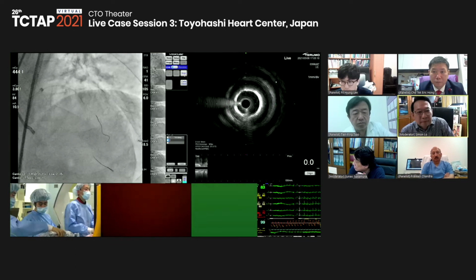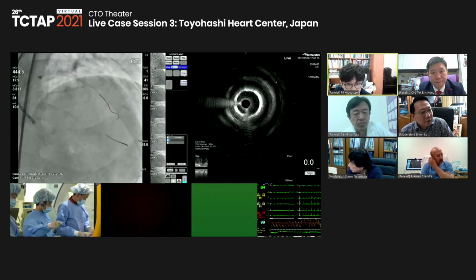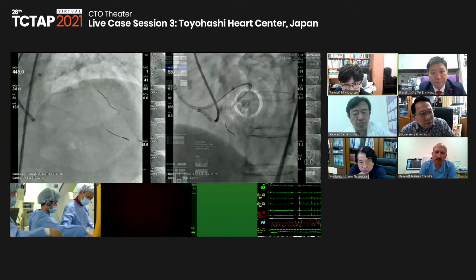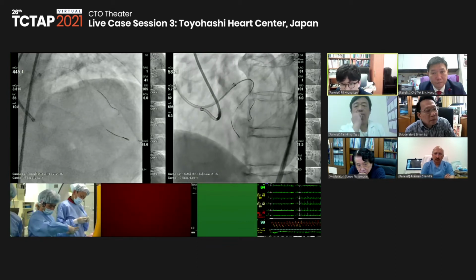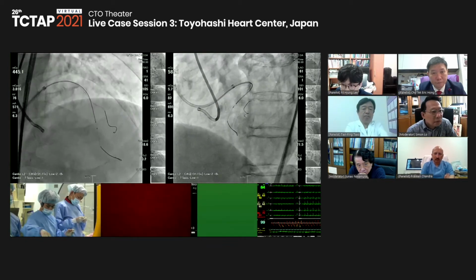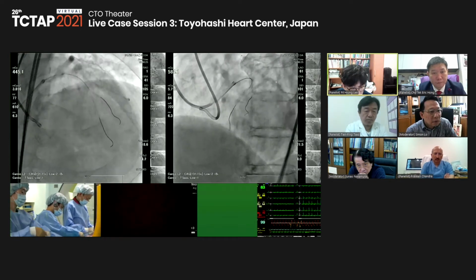Yeah, I agree. And geographically, maybe the small channel has a competition from the retrograde. I think so too. If it's lucky, we can pass it very easily. So I hope so.